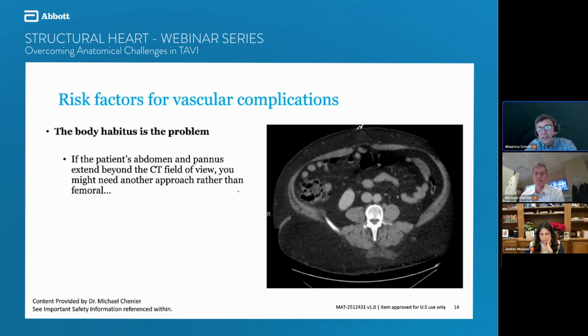You have to find the right spot to stick, where the vessel is free of calcium, and to do that, you have to study the CT scan way in advance. You also need to study the trajectory and curvature of the vessels, and whether or not you can overcome a significant calcified bend. If that's not the case, go to an alternative access.